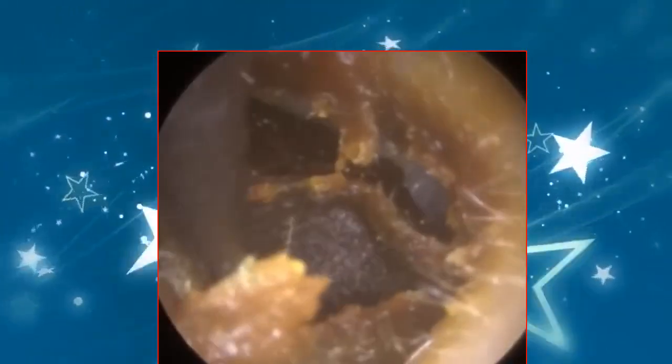So just using the Jobson horn, because it's that mushy, soft wax, you can get in and behind. So I did manage to remove quite a lot with the Jobson horn, but eventually I did put some olive oil spray into the patient's ear just to change the consistency, and I reverted back to suction to get it out in a big plug.